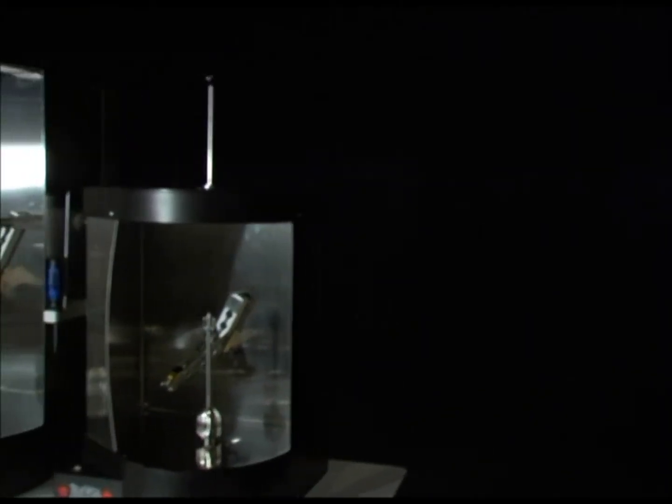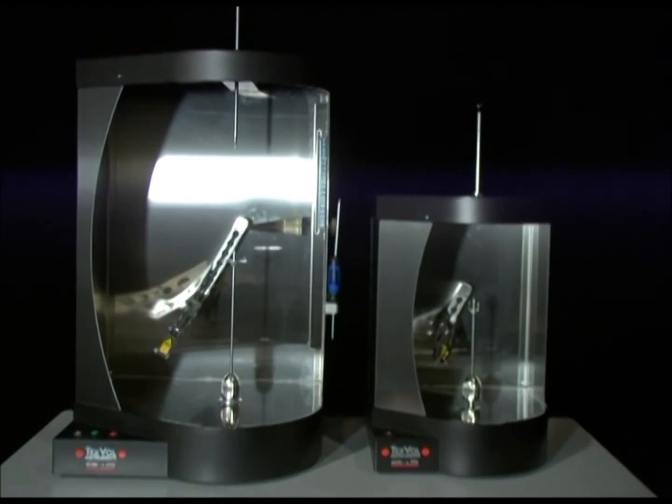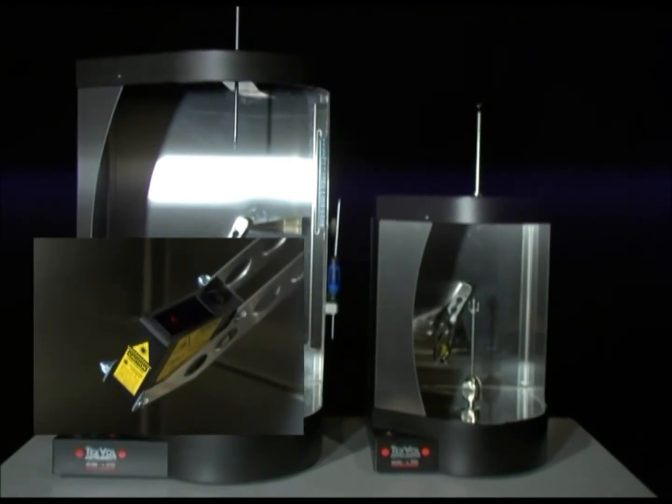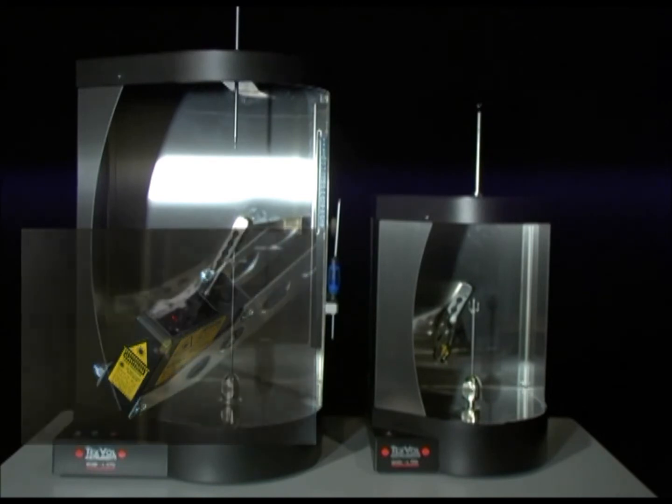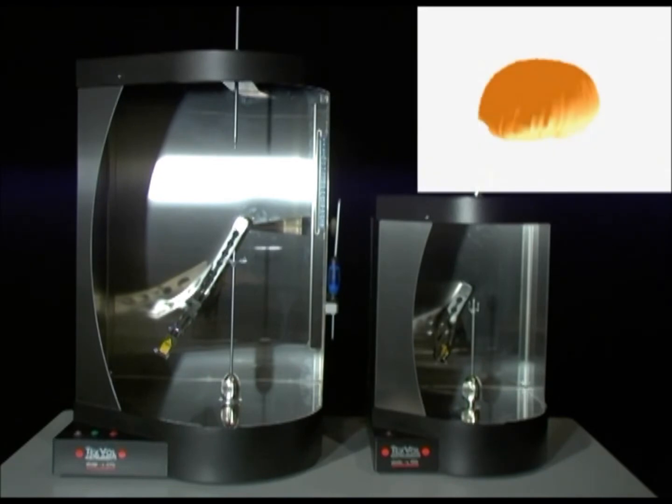The BVM is an instrument that measures the volume of a specific product. The system is fully computerized and is conveniently operated using menu-based commands. A product is placed on a rotating support and the laser moves in a half-circle around the object. The dedicated software for the BVM calculates, among others, volume, dimensions and specific volume of the object and presents the results and a three-dimensional image on the screen.